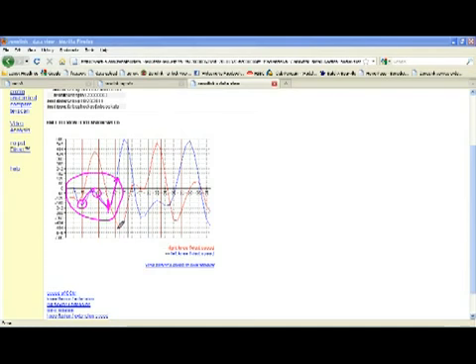the gait. What's interesting is you'll see that she has a large extension speed as she moves forward to heel strike. There's the lull, but then there's virtually no extension speed on the initial gait cycle on the right side. And then she does pull into flexion fairly well, but very, very little extension speed on the right side. On the left side, then, you see the extension's a little bit early, close to toe off or heel strike. Then you have heel strike here, so she's pulling the knee in already as she gets in the heel strike. Lull through mid-stance, again, a really limited extension.